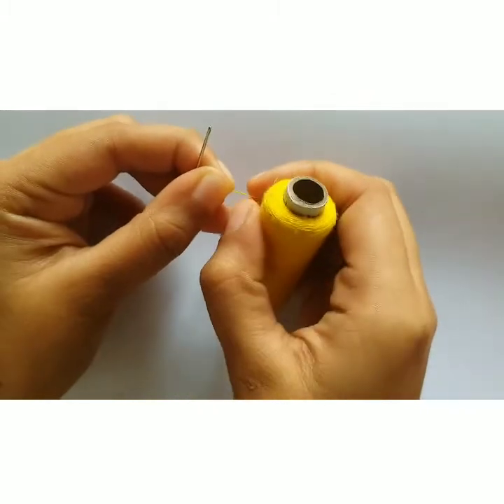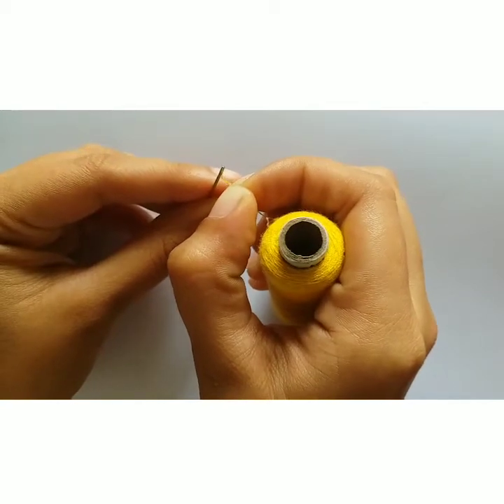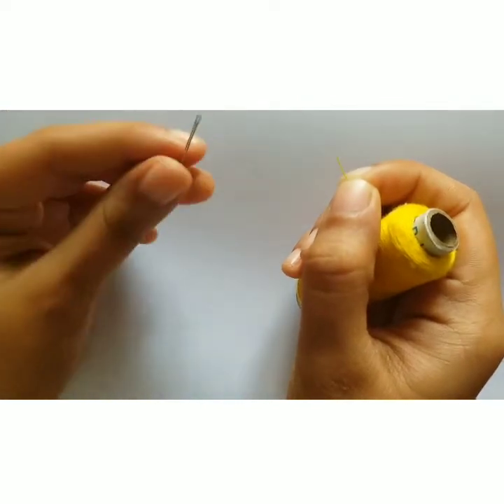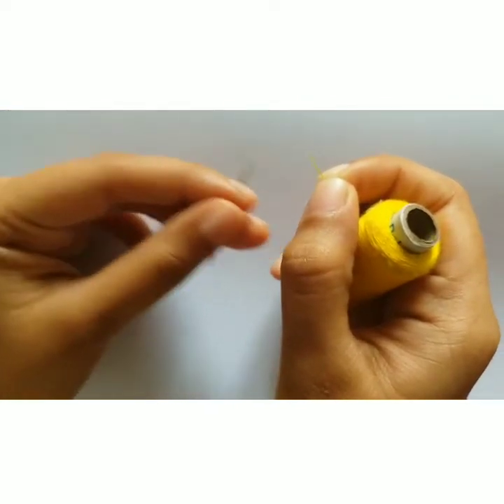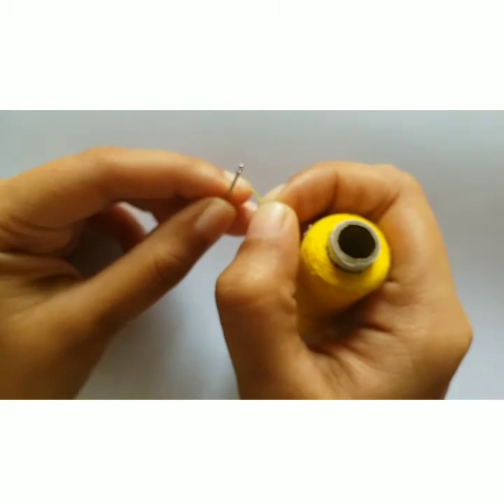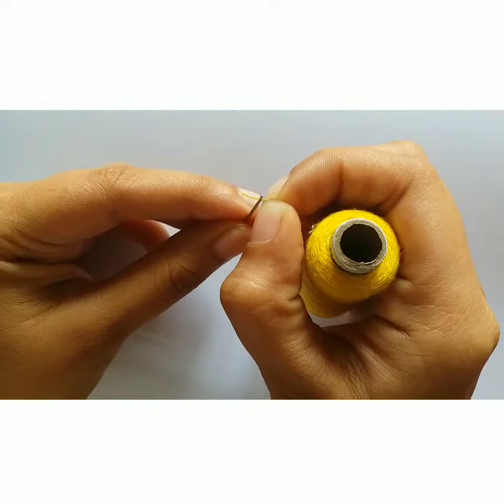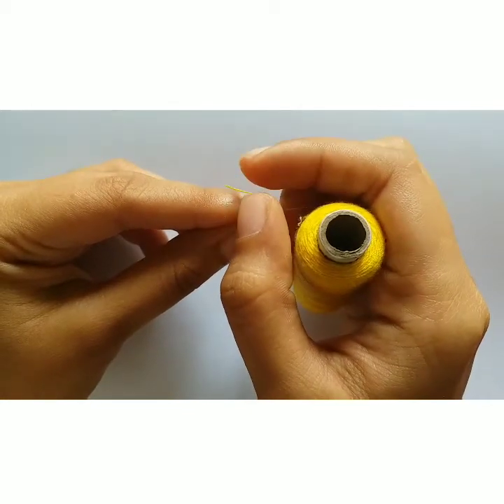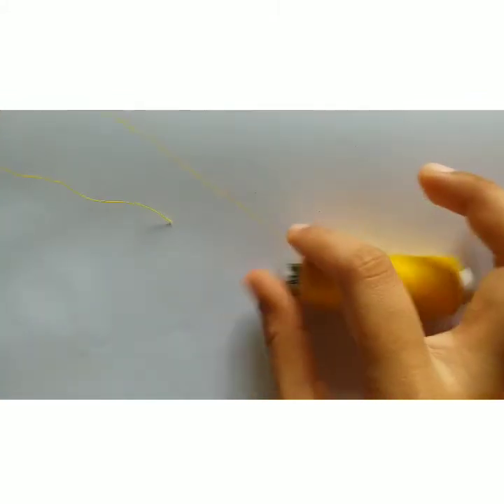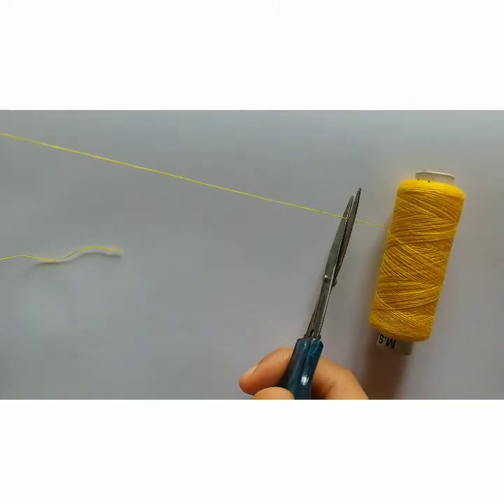The next step is threading of the needle. Usually, we hold the thread with one hand and put it in the needle. But here, we're going to do it the other way. We need to put the needle in the thread. My left hand will move, the right hand will be static. That's how I'm inserting the needle into the thread. I will grasp it with finger and thumb, take the required quantity of material, and cut the extra.